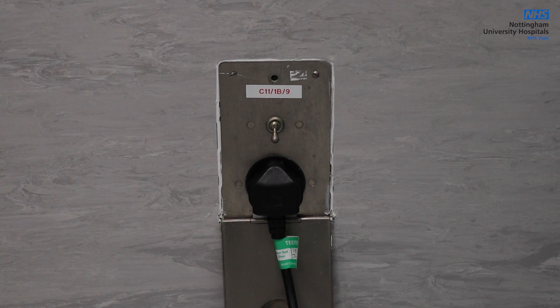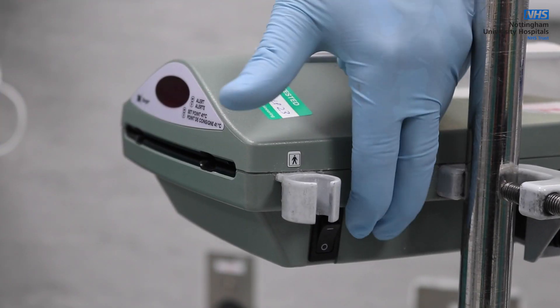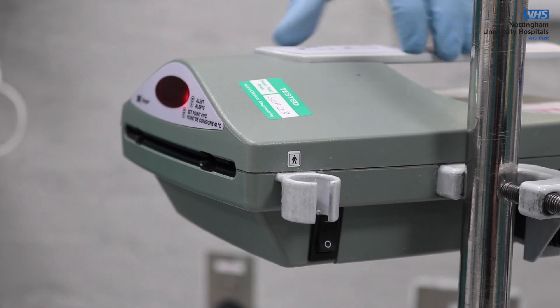It requires mains power to operate as the device does not have an internal battery. Once connected to an appropriate power supply, the device can be turned on using the power switch located at the side of the device.